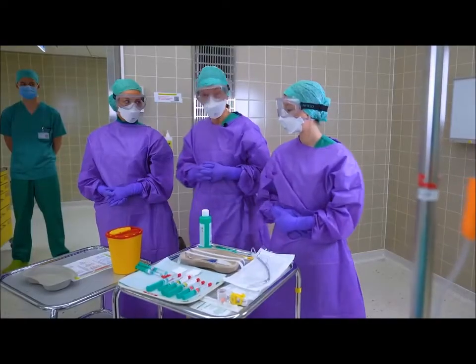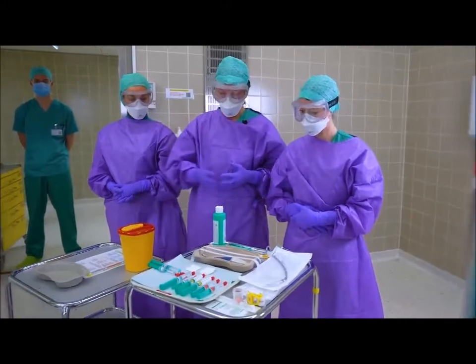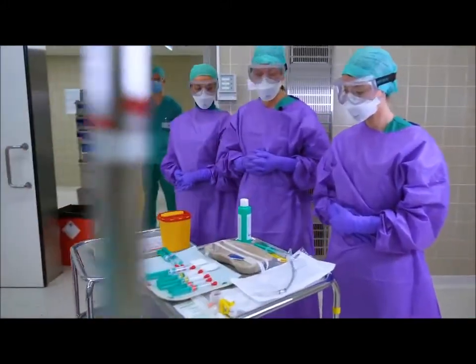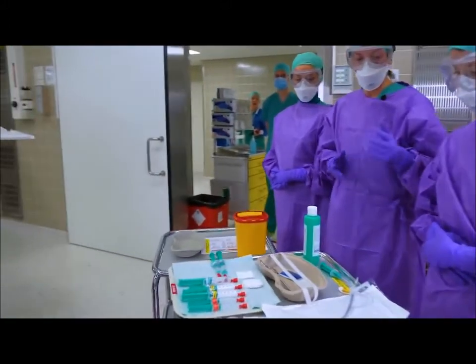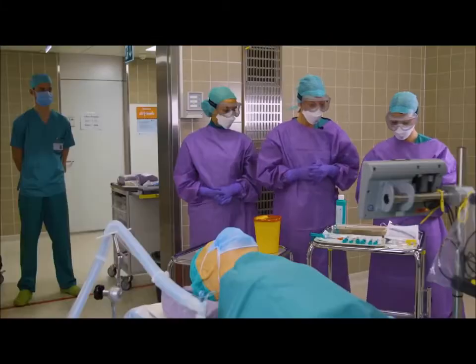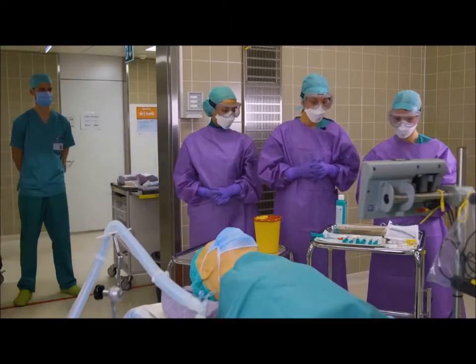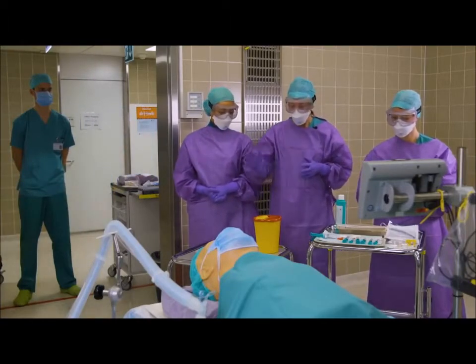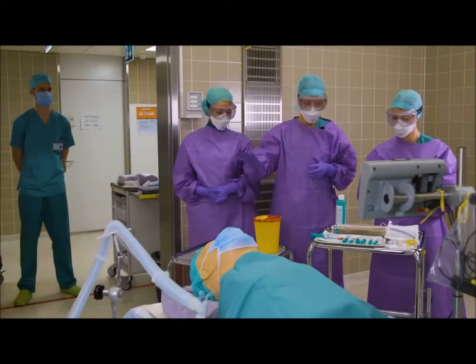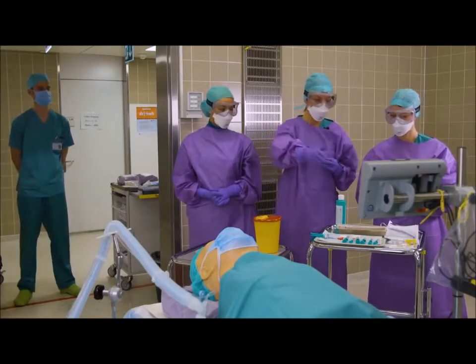For induction, we have our medications on the tray, as well as our airway materials, including an endotracheal tube with a stylet in place, as well as our video laryngoscope. Next to the induction table, we have our dirty tray for dirty materials to be disposed there. It's also important to have a trash bin next to the patient so you can drop dirty articles right into the trash bin.